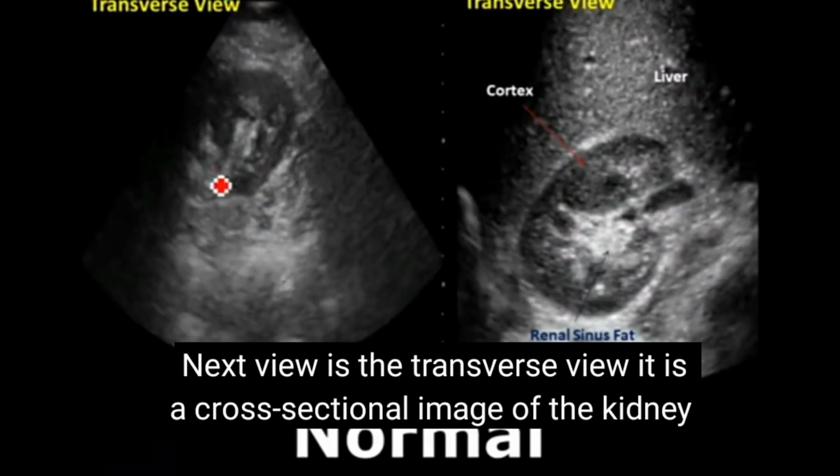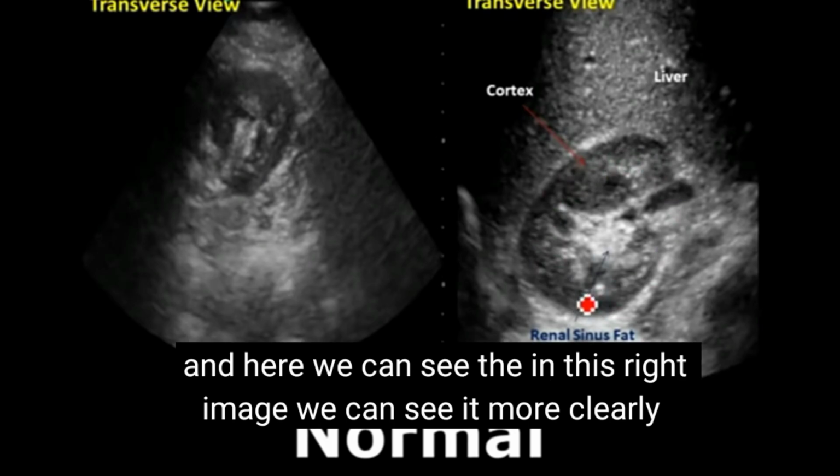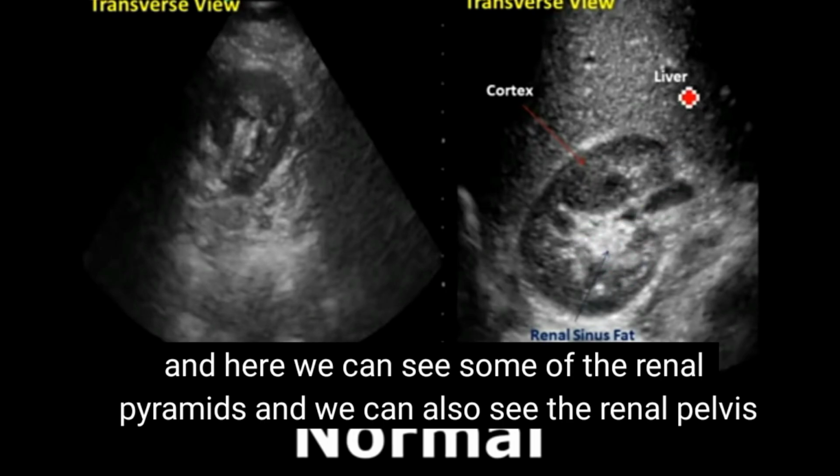Next view is the transverse view. It is a cross-sectional image of the kidney, and here we can see the right image. We can see it more clearly. We have the cortex and the renal sinus very well visualized, and above them is the liver. And here we can see some of the renal pyramids, and we can also see the renal pelvis.